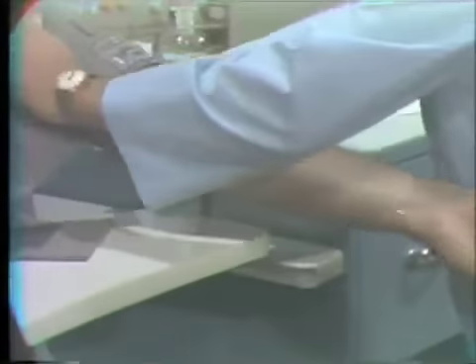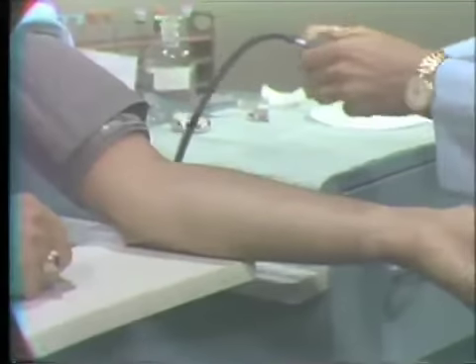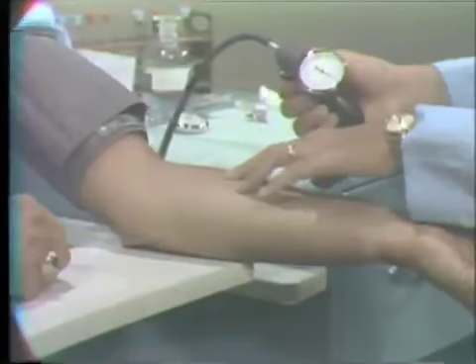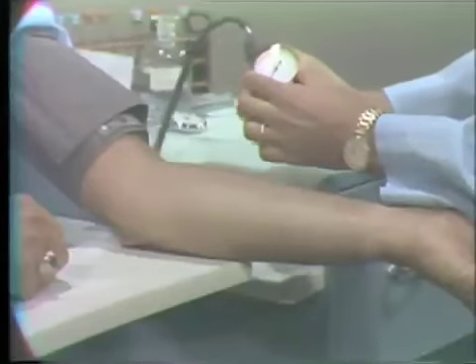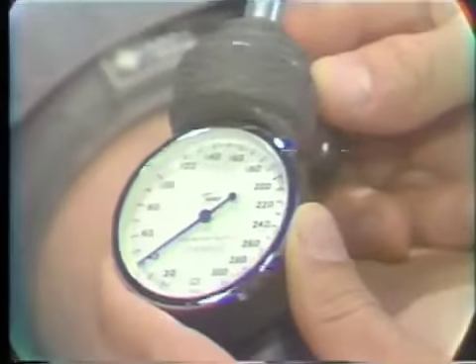Then we'll go ahead and apply the blood pressure cuff. The blood pressure cuff is applied as any blood pressure cuff for taking the blood pressure on a patient. It's applied snugly. Then we will inflate the cuff to get a standardized pressure on the vasculature to standardize the test and make it reproducible, up to 40 millimeters of mercury. And you'll notice that we now have it at 40 millimeters of mercury.